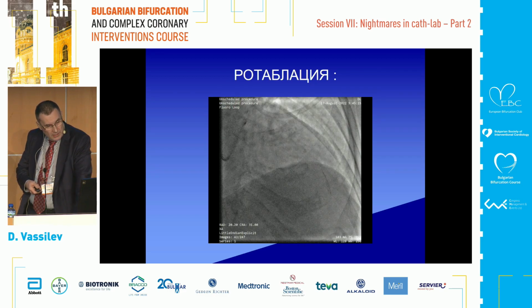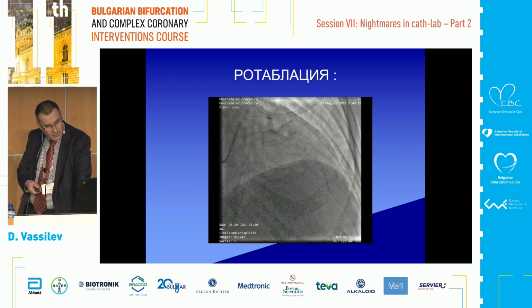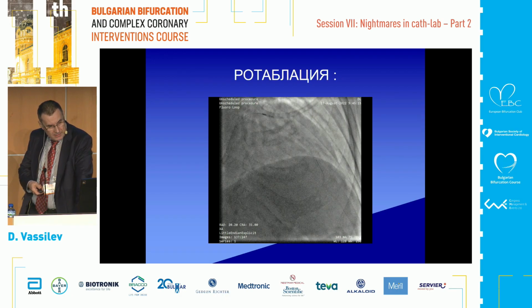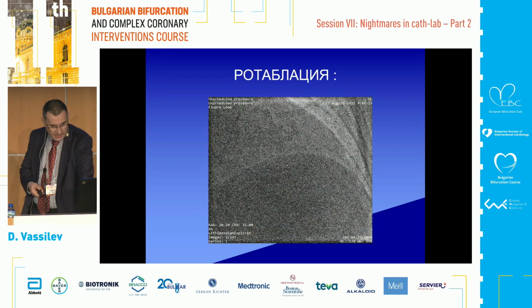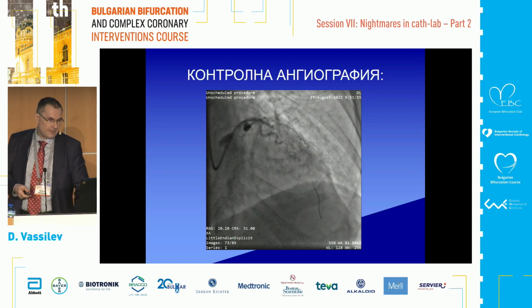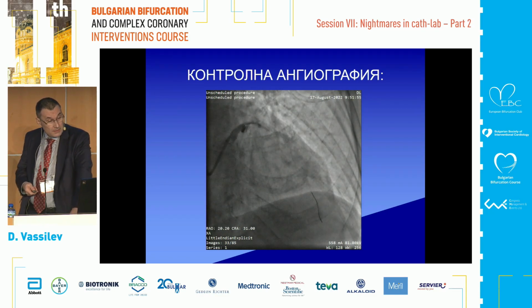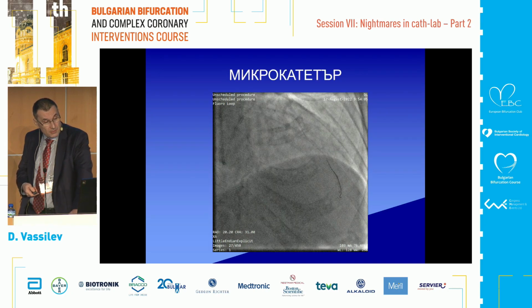So we performed rotablation with a 1.25 burr. However, it did not pass even the proximal segment of the LAD, and as we approached the mid segment, the patient crashed. We gave catecholamine, some resuscitation there, and it was time to change strategy.